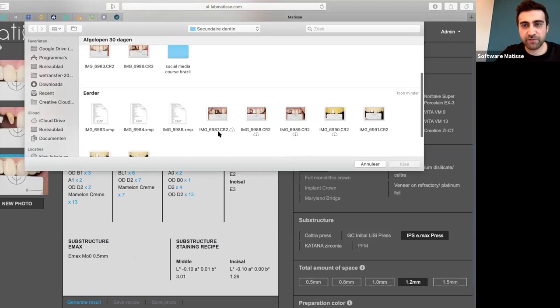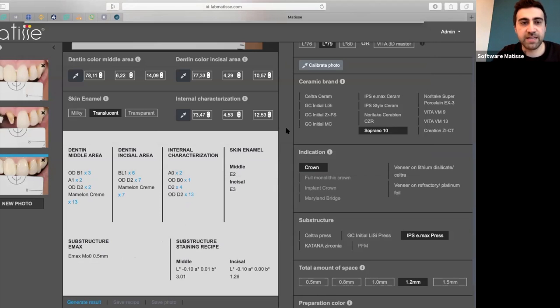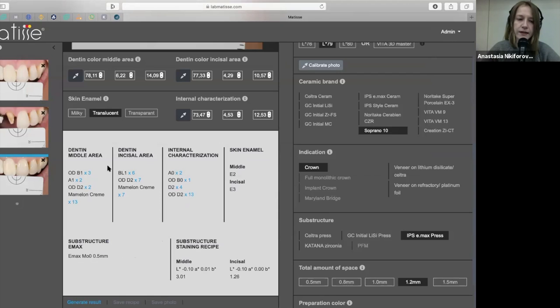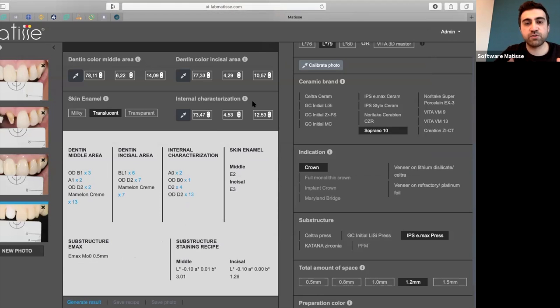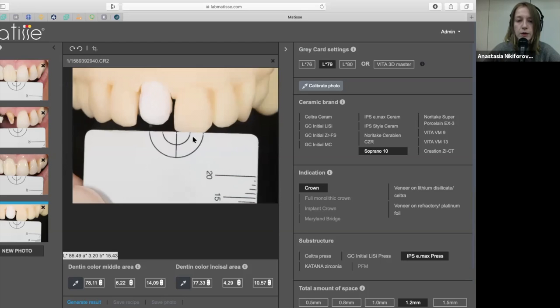When the framework comes to the lab, you make a picture of the framework on the gypsum. The best thing is to work with printed models or to replicate the prep sheet. With printed models, you can fine-tune the prep with optiglaze, for example. You can treat the preparation margin with optiglaze.